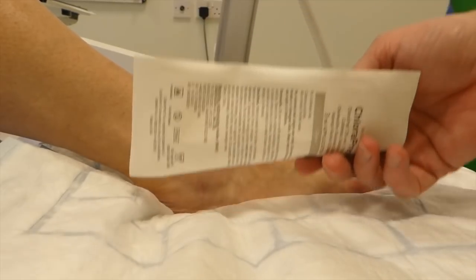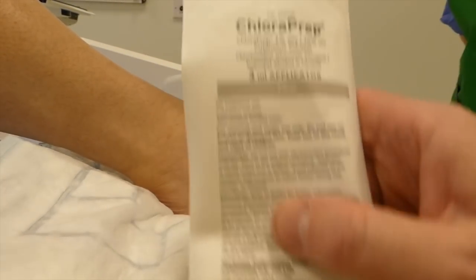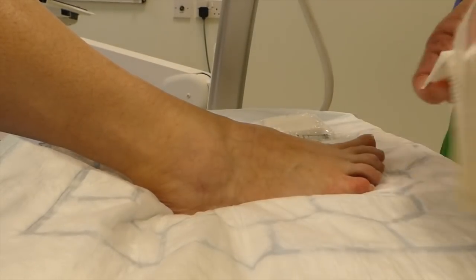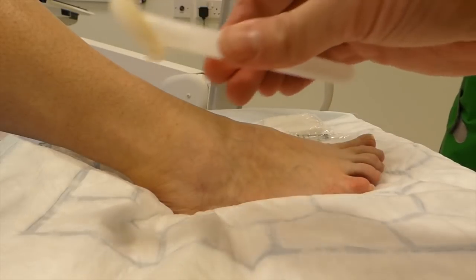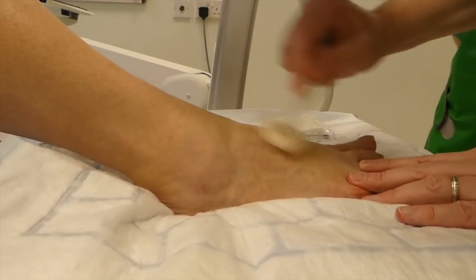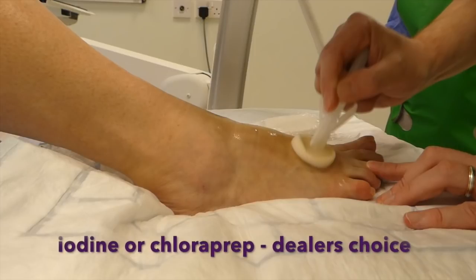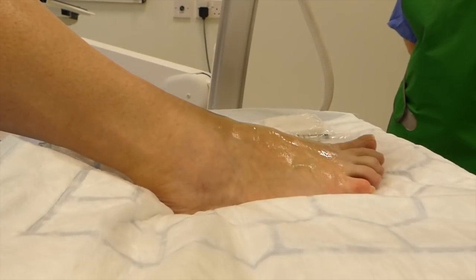I kind of like these chloropreps. Let's just see if that works on the camera. So these are chloropreps — we really like these. Nice single use. Give them a little click. Big fan of iodine as well, but these are just nice and convenient. And then we bin that.